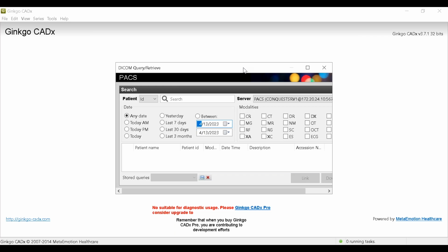Or pull it down from the archive. Those are terms you might hear people say, right? Pulling being I'm reaching out for information and pulling it in, pushing I'm just throwing it to you. And so often the terms pull and push in DICOM are relative to where your butt's sitting at the time. If it's going away from you, it's a push. If it's coming to you, it's a pull, and it changes based upon who's saying it and where they were sitting, right? We're going to go ahead and pull down an image.